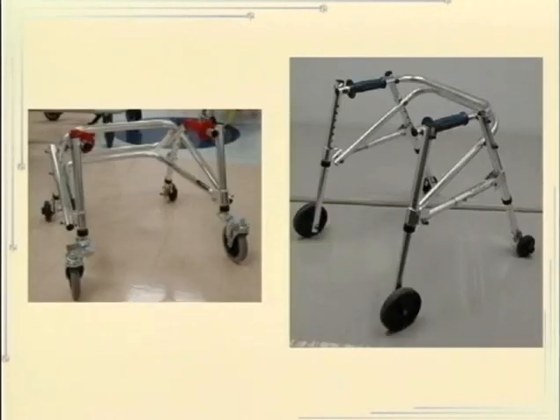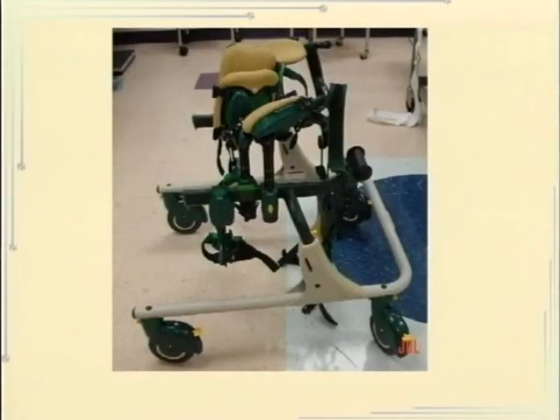Standard walkers, anterior, posterior walkers, I don't need to tell you about them. They're usually an aid to walking. And this is something that we use in kids called a gait trainer. And it's sort of like a walker with extra straps built in and extra pads. So this would be for someone who has less control of the legs but still wants to get around. And they're on wheels, and they can be customized, and different straps and pads added depending on how much support is needed. And these come in small, medium, and large sizes too, so they're not just for kids.